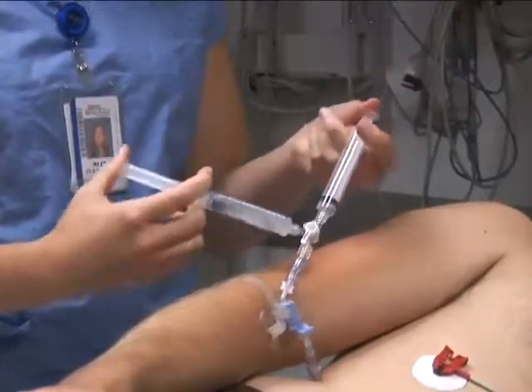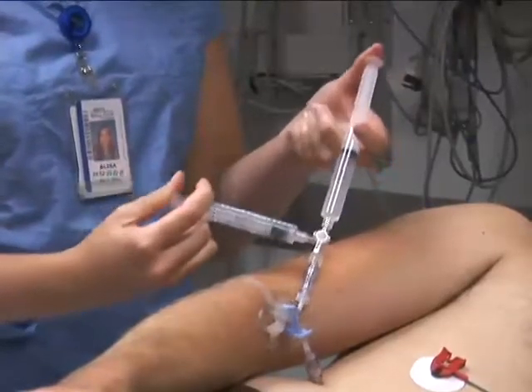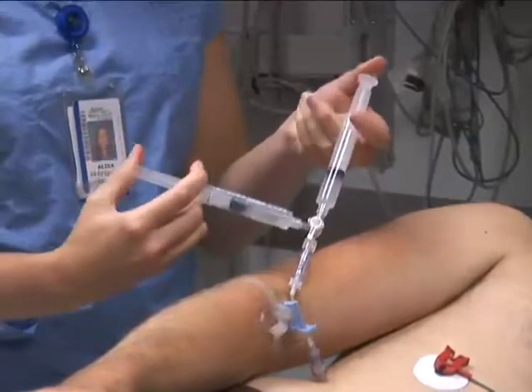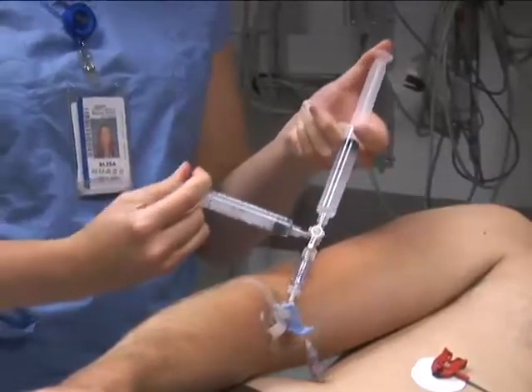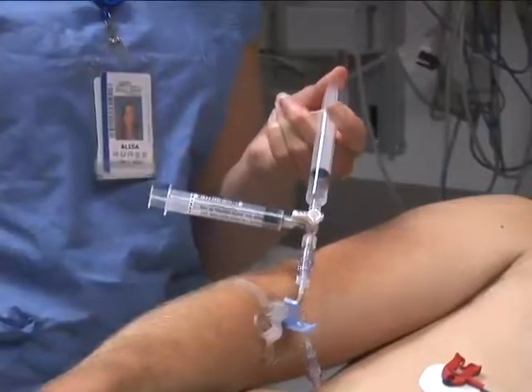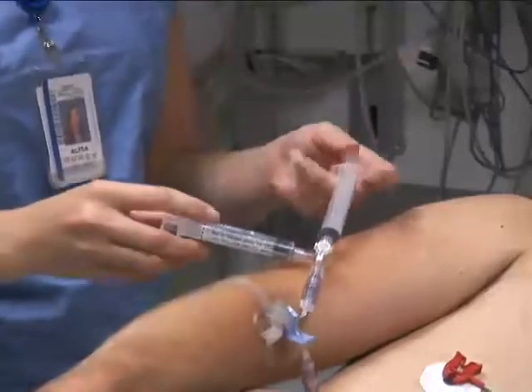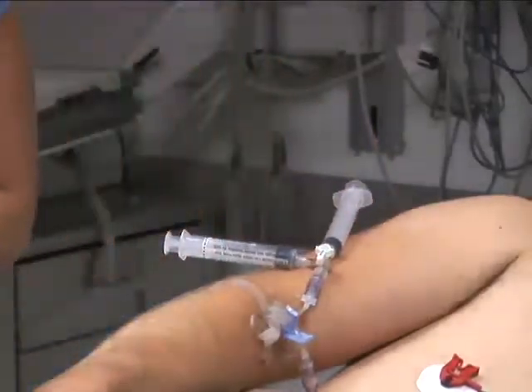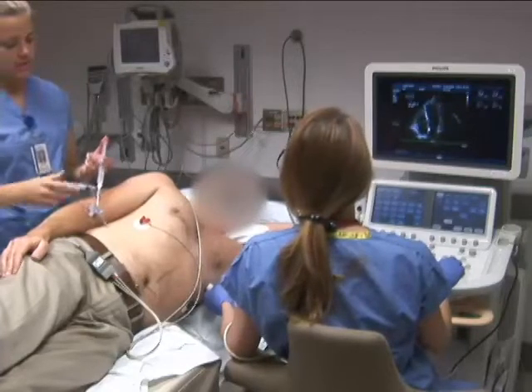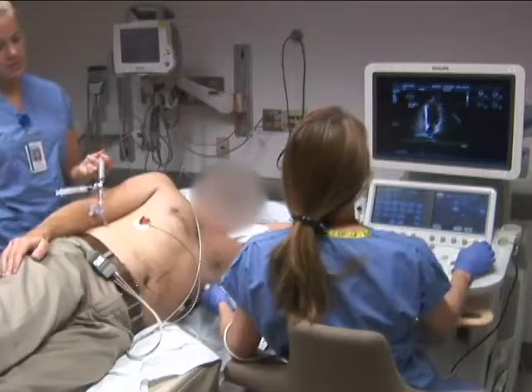Verbal cues are established between the sonographer and the nurse, who will be injecting the saline, to ensure a coordinated effort with recording of images, starting just before contrast appears in the right heart. When the agitation is complete, and on cue from the sonographer, the stopcock is turned off to the empty syringe, and the bolus is injected into the patient. Echo images are recorded in 6 to 8 beat loops to ensure the entire contrast sequence is captured.